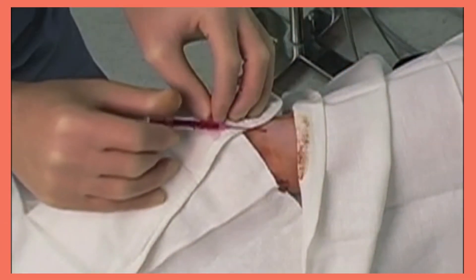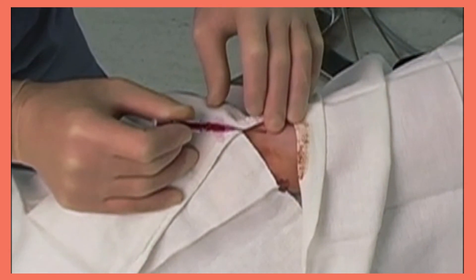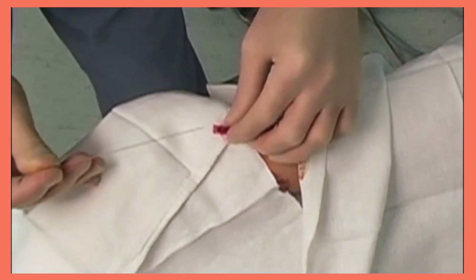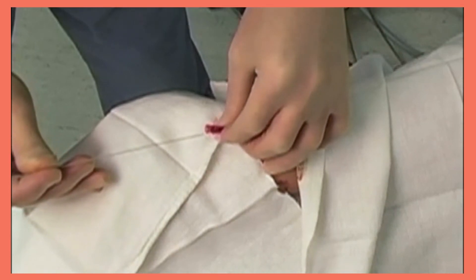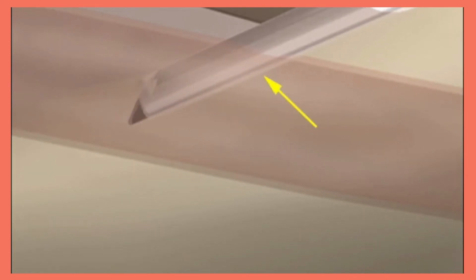There are some common problems that can occur during arterial line placement. If, in the over-the-needle technique, no blood return is obtained after the initial flash, the catheter can be advanced through the vessel and the over-the-wire technique can be employed. Occasionally, free flow of blood is observed but the catheter will not pass easily. As shown in the animation, the tip of the needle might be within the vessel while the catheter remains outside. By advancing the needle slightly farther after the initial flash of blood, the catheter can enter the artery, allowing for successful cannulation.